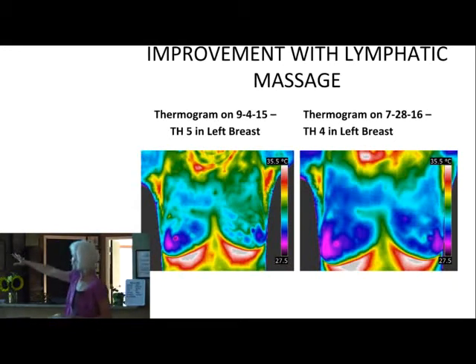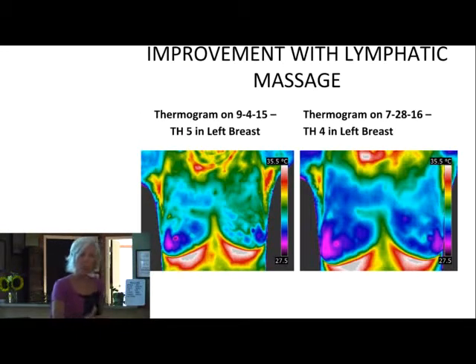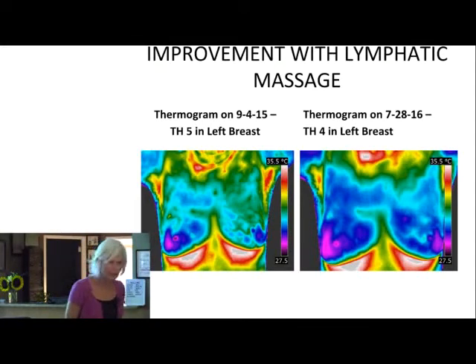So I'm so proud of this lady, and she's obviously tickled to death that she's been able to do this since April. Because again, things like this don't usually correct themselves in this short amount of time. Someone who's a high risk 4 or 5, I say, I don't want you to go longer than 6 months without re-imaging. You're going to work a plan, but you don't want to go too long before you see if it's working. Because we don't want the heat going farther, increasing more.